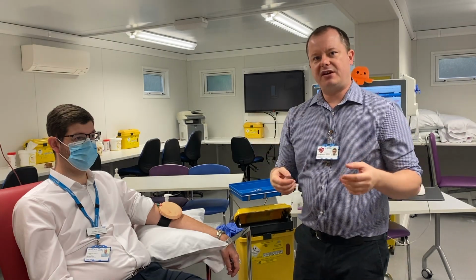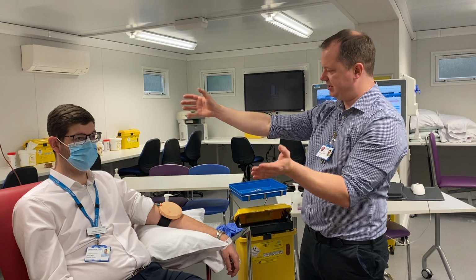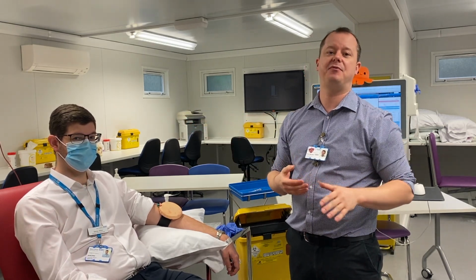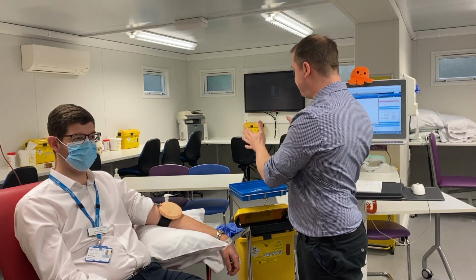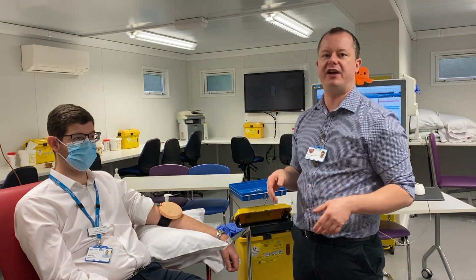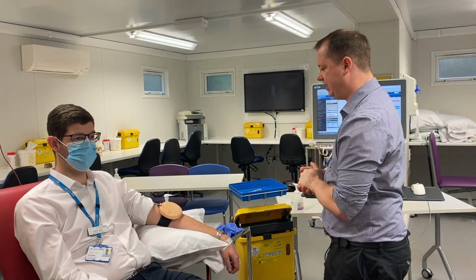So, hello everyone. I'm just going to run through taking a blood test from a patient now. I've got my standard patient here. Hello, James, as always, and I've got Tina behind the camera for moral support. Hello. So I have prepared my tray just like we have done in the previous video. That's all prepared and ready, and I've brought with me all my ways of identifying the patient.